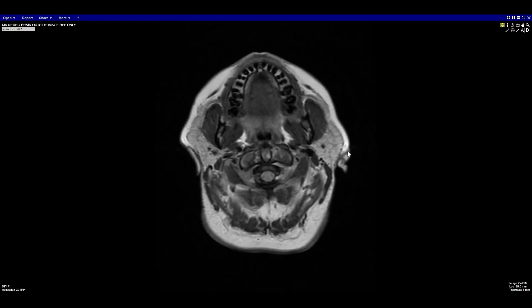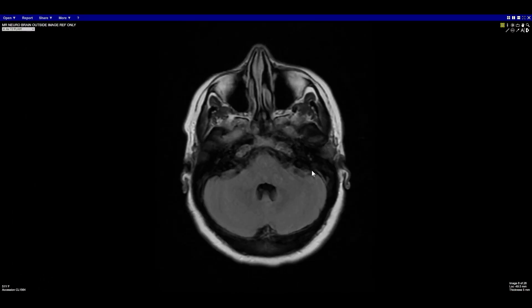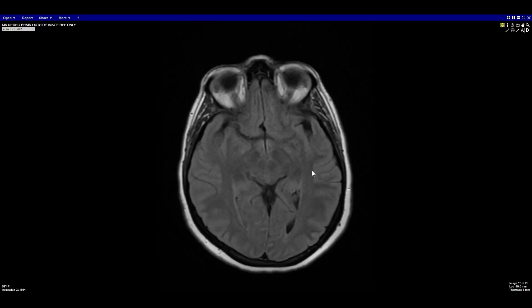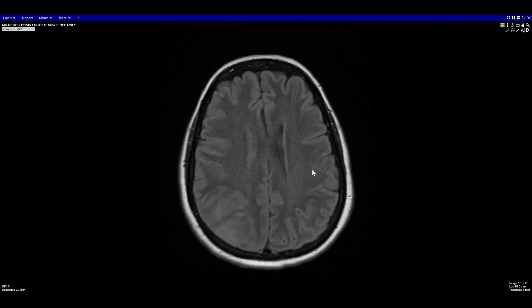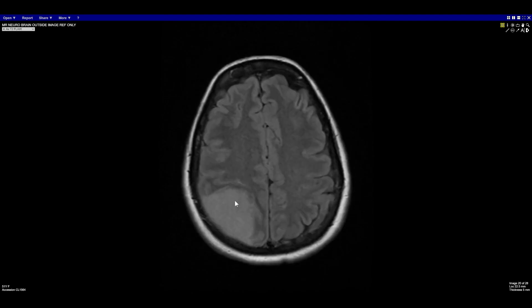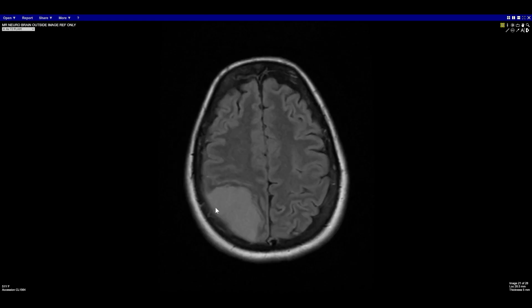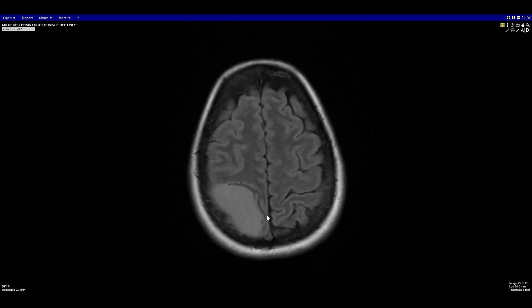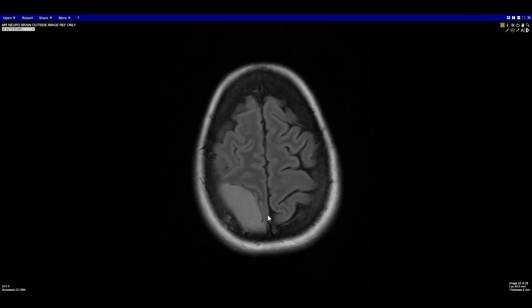On FLAIR, we can jump to the top where we're expecting the abnormality. We see a FLAIR-hyperintense mass, pretty homogeneous, with a broad dural attachment. The brain looks smushed away from the mass, which is important because it suggests the mass is less likely to be coming from within the brain parenchyma.